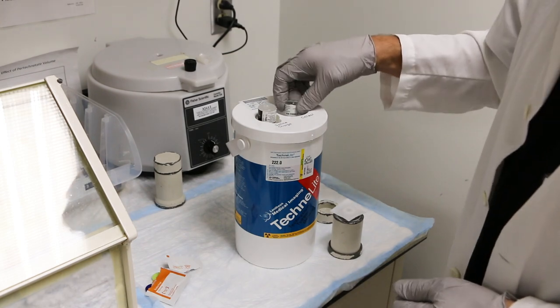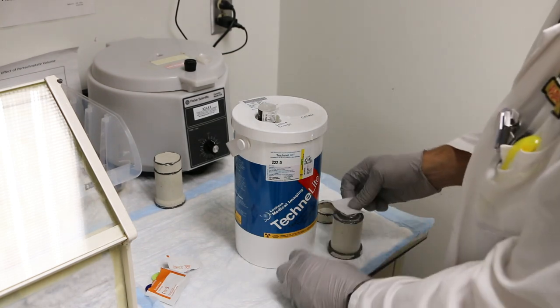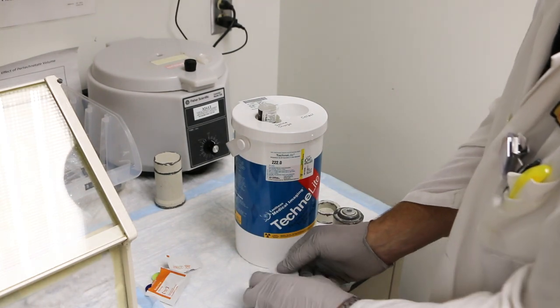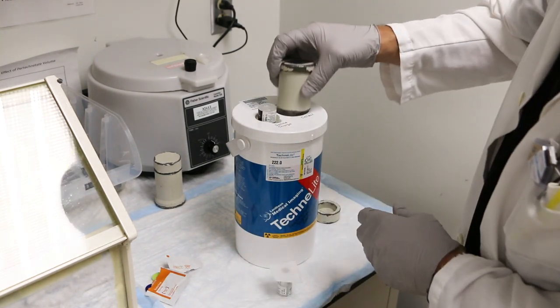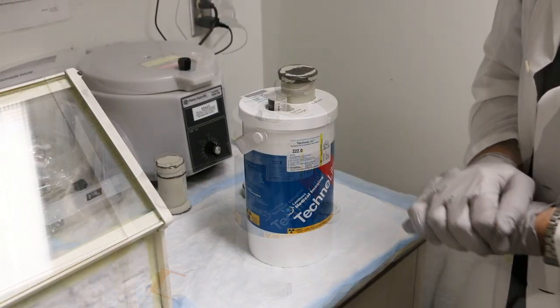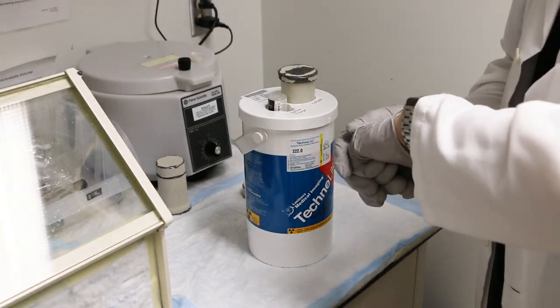Remove the collect needle seal vial from the collection port and set to one side, keeping sterile with an alcohol swab. Place the collection vial on the collection port. The elution process begins and lasts for about 5 minutes.